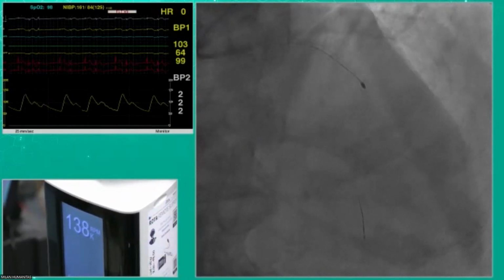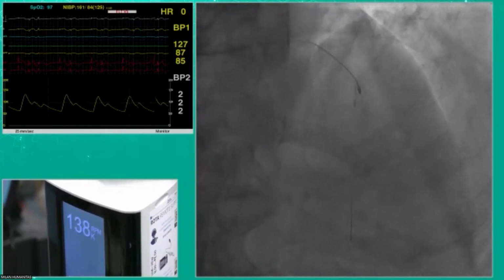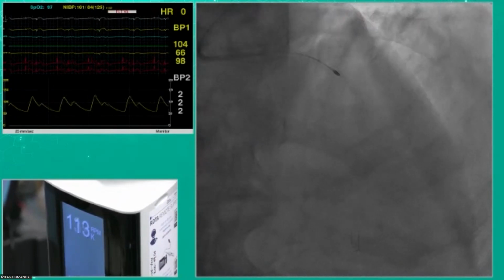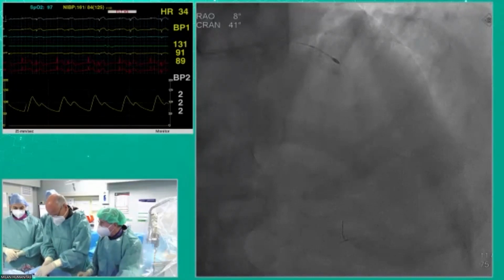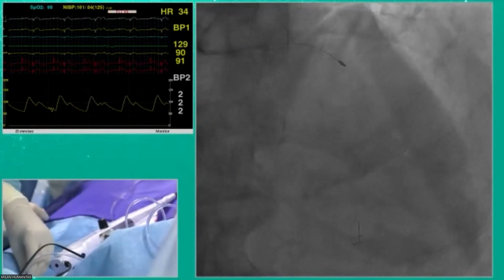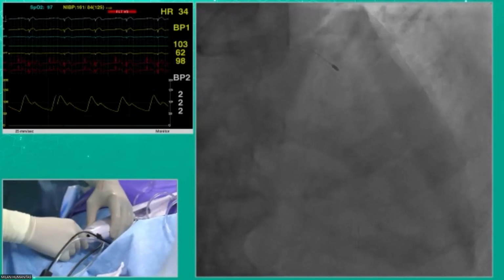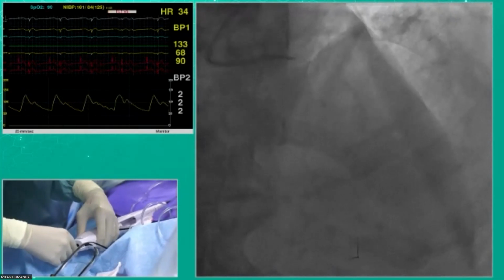Also a bit more proximal, because there was still that lesion. Okay. Because we have to get material down here. I think it's worth it to pave our way. Okay, let's go to DynaGlide, come back, take it. Wait a second, I have to get the wire nicely free. There is a stump of debris, he needs to digest, because we did a pretty aggressive rotational.